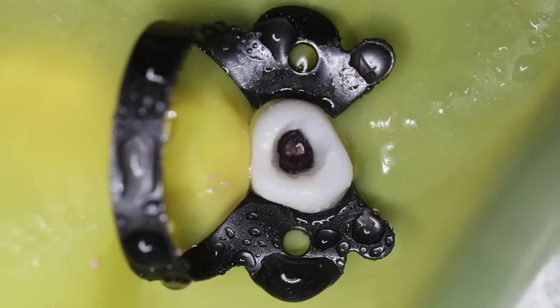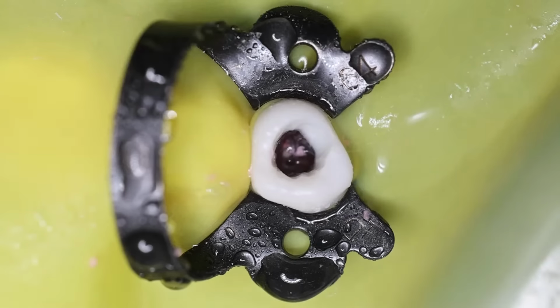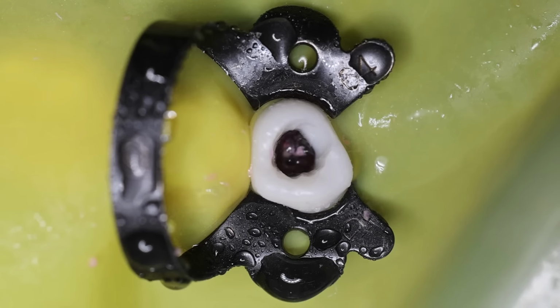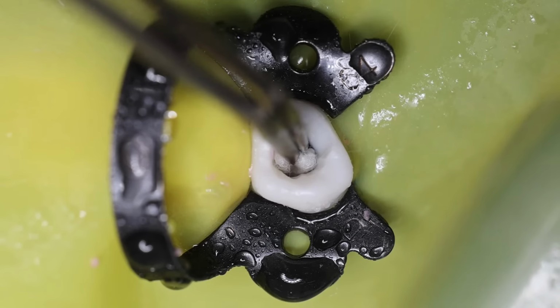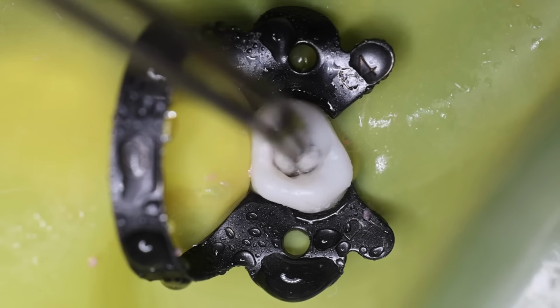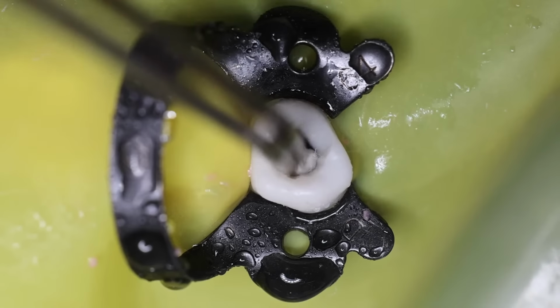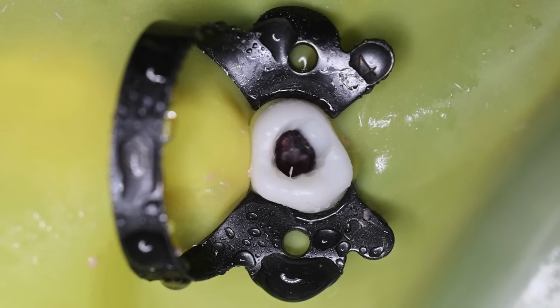Now once you have removed it, use a sterile cotton pellet soaked in saline and place it into the pulp chamber for a little while, like 3 to 5 minutes, to achieve hemostasis, so that there is no further bleeding over here. Okay, once you have achieved hemostasis, then you can begin with MTA.